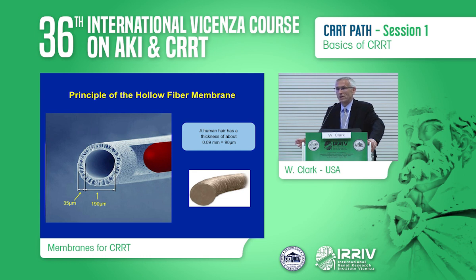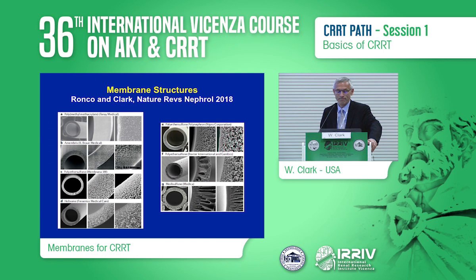That's essentially what we're going to be talking about for the next 30 minutes, and some of the underlying principles behind that process. Obviously, it's a very complex process that I've very significantly simplified. There will be some aspects of this presentation that overlap and maybe extend what Dr. Ronco mentioned. For the most part these days, we're just leveraging membranes that are produced primarily for a chronic application. We're applying those in the acute world.